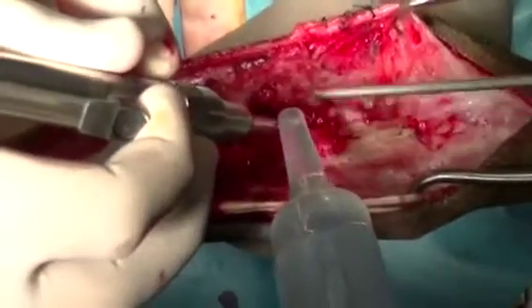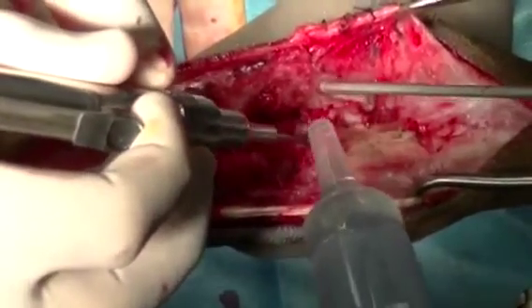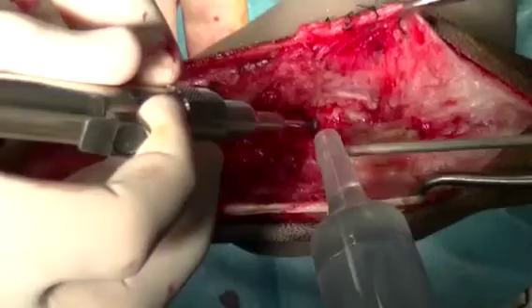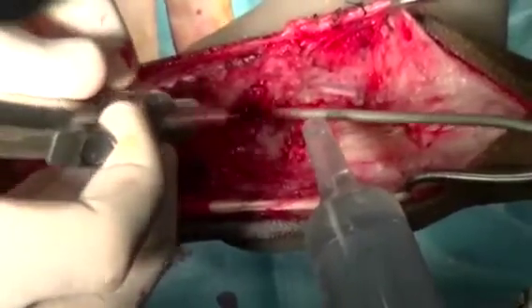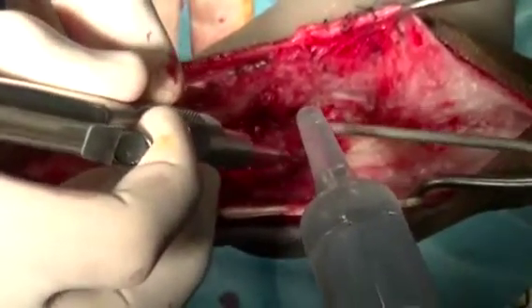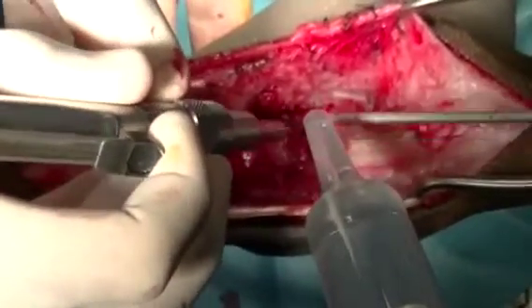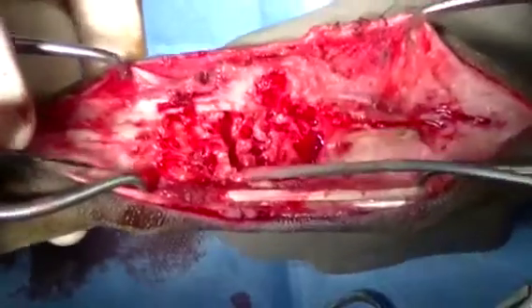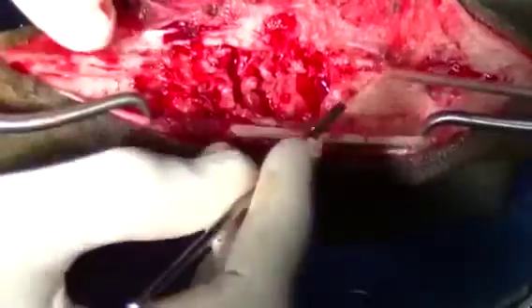A high-speed burr is used to remove the cartilage from the articular surfaces so that bleeding bone can be exposed. Later on in the procedure, we're going to put bone graft in here, and with rigid fixation, ultimately this will turn into one single large piece of bone. Here we can see that all the articular surfaces have been debrided using the high-speed burr.